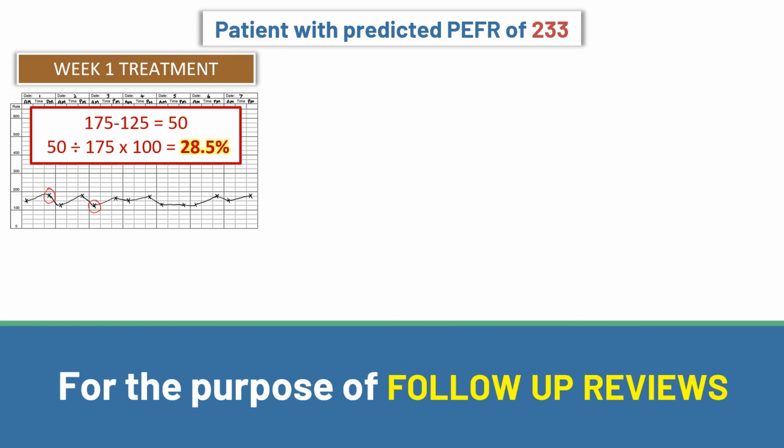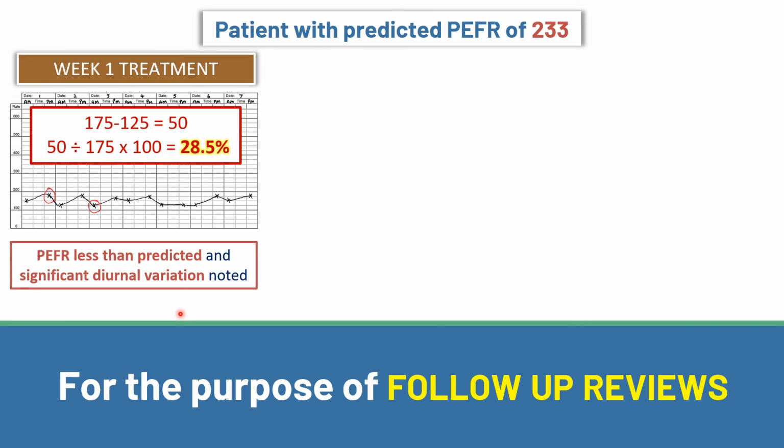So the next bit is you've got to comment on it. And what I'd be saying here is the diurnal variation is 28.5%. Well, we know that that's bad because it's way beyond 10%. And I'd say that the peak flow baseline is less than predicted. So that's how I'd interpret that.